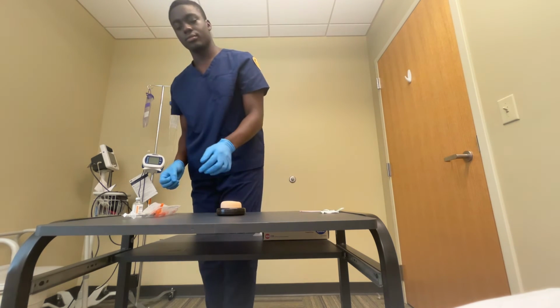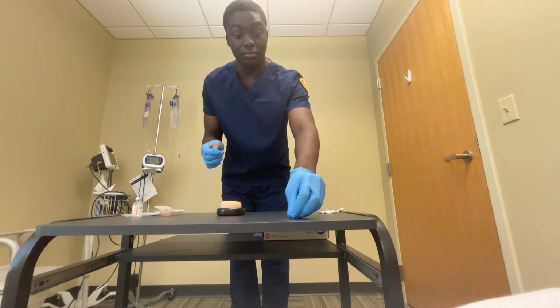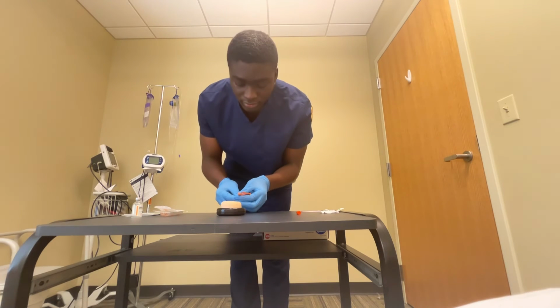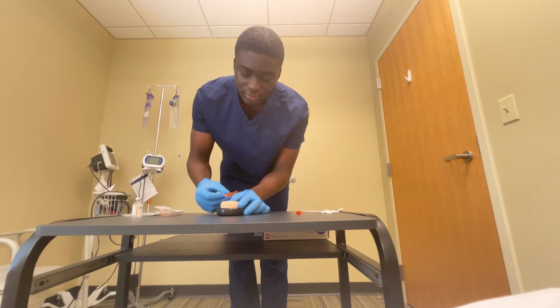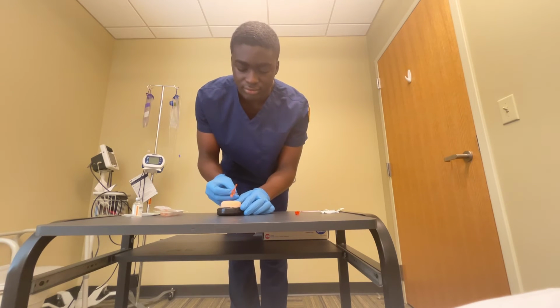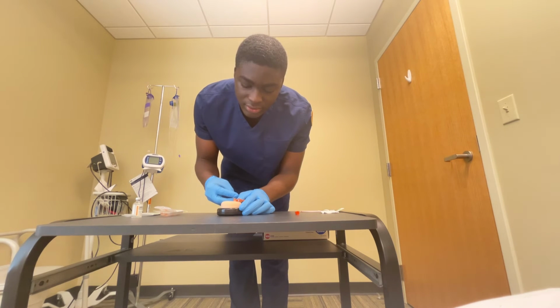Let it air dry. Click my needle. Remove the cap. Ensure that the bevel is up. Hold the skin taut. And then let my patient know they'll feel a small pinch. Make sure I can see the bevel up within the skin. And then at a 5 to 15 degree angle, inject my 10 units.